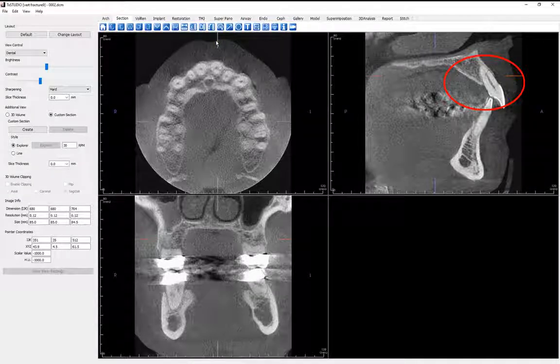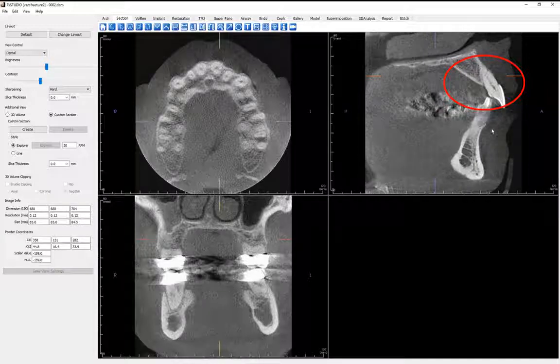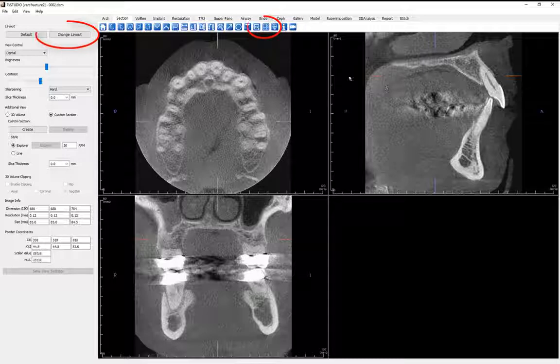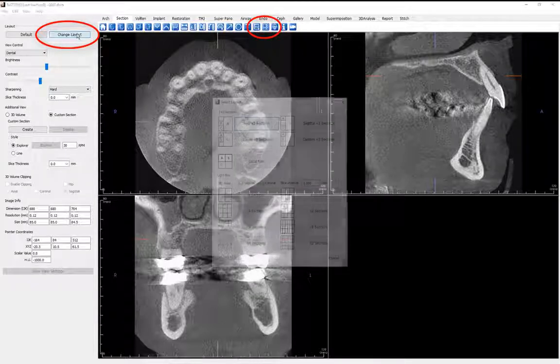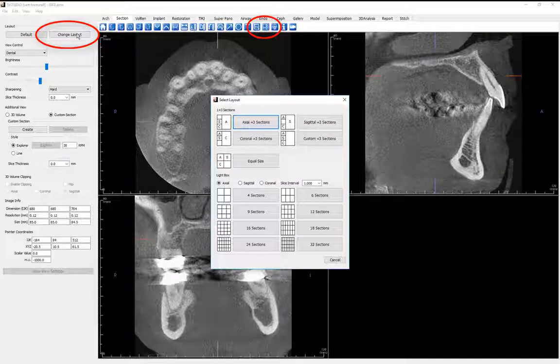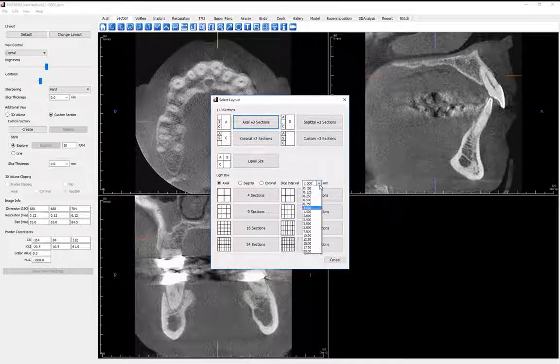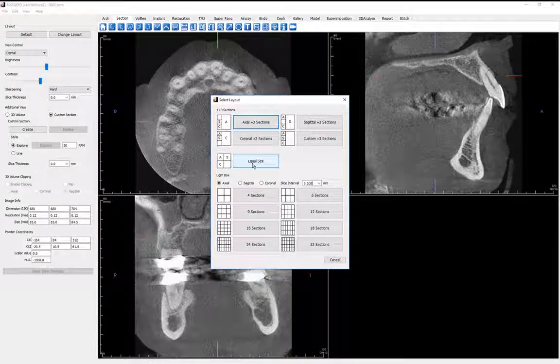Let's use the mouse wheel to scroll through the slices. You may want to minimize the slice interval range so that more detail will be seen. To do so, click on either of the change layout icons, then choose the slice interval. To lock in the change, click on a section or light box preference.